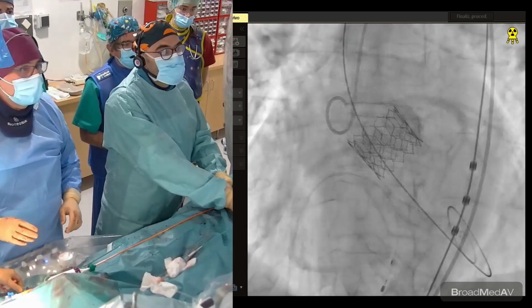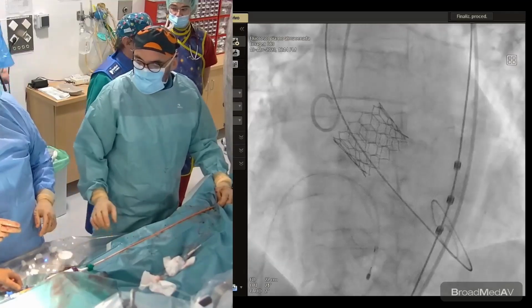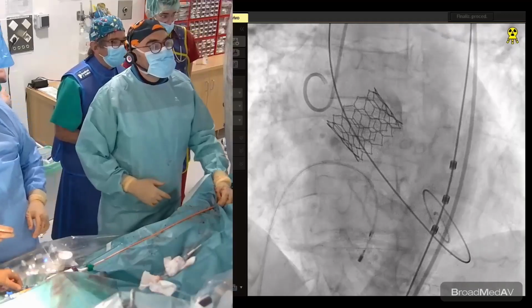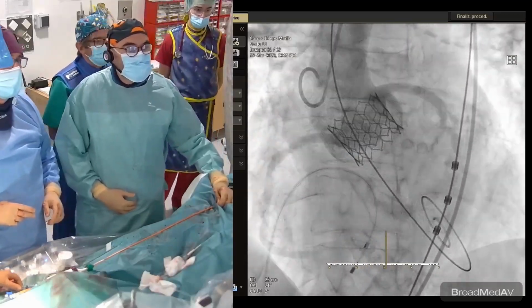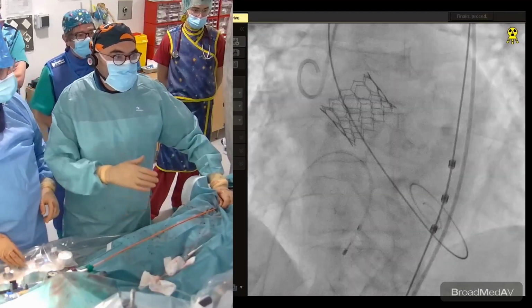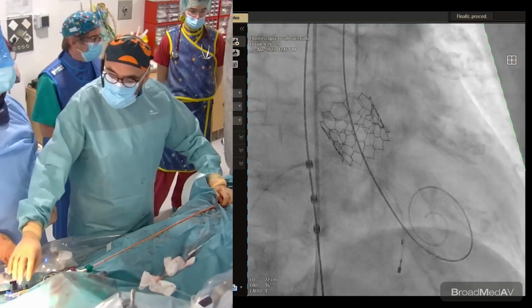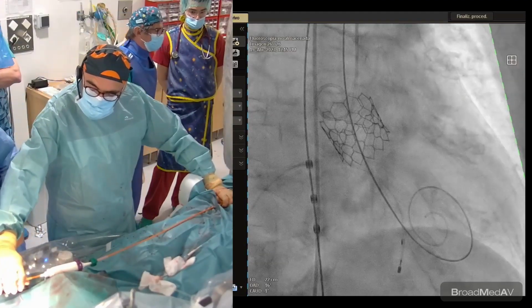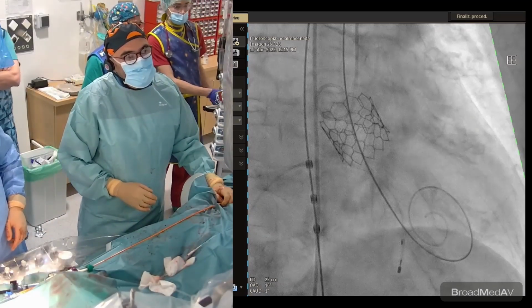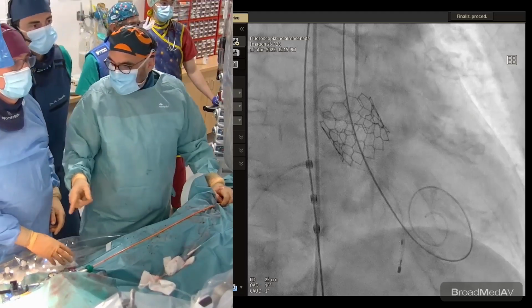If it's necessary, we can post-dilate with this balloon with 2 cc more, but now we check. I think the position is good. I think no PVL, almost no PVL. Maybe a very trace, maybe even related with the wire. I think that the result seems very good.